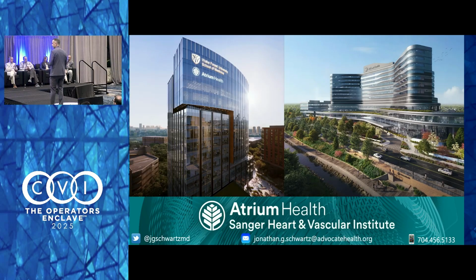Great case. So clipping the AP commissure, what's nice about that is that it's the perfect alignment for the ICE probe, because it's zero, right? So it's the one view that we can actually see a lot with the 4D ICE. Technically, Jonathan, do you want to comment on maneuvers for clipping in the AP?